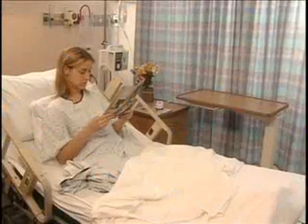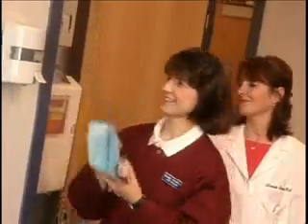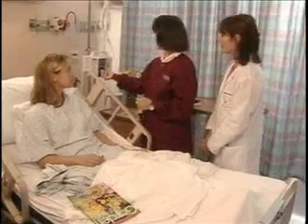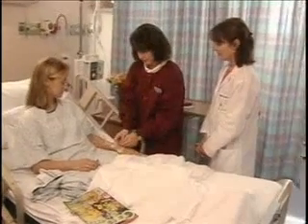Mrs. Markowitz? Hello. Hi, Ms. Markowitz. Hi. We're here because your IV site dressing is loose. I'd like to change it for you now. Would that be okay? Please do. Okay, I just need to check your ID band. Can you tell me your full name, please? Sharon Markowitz. Okay. I'm going to turn off the pump and clamp the line.